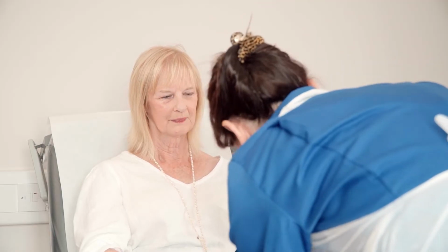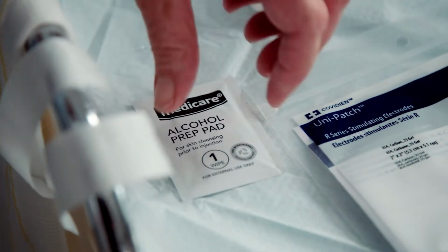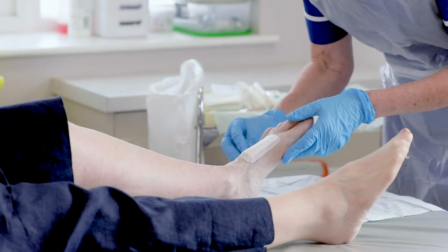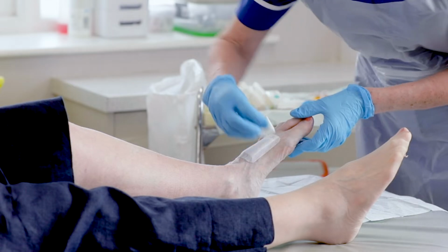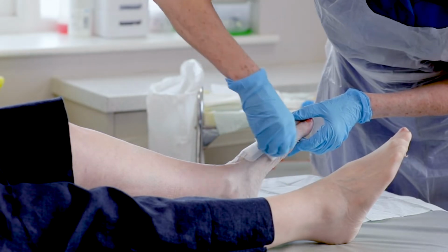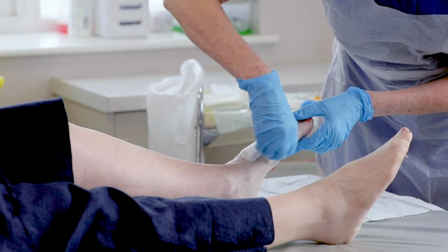Prior to applying Accel-Heal's electrode pad, ensure any excessive dry skin is removed and avoid using emollients. The selected area needs to be cleaned with the wipes provided within the treatment pack. This preparation will ensure a good adhesion of the electrode pads.